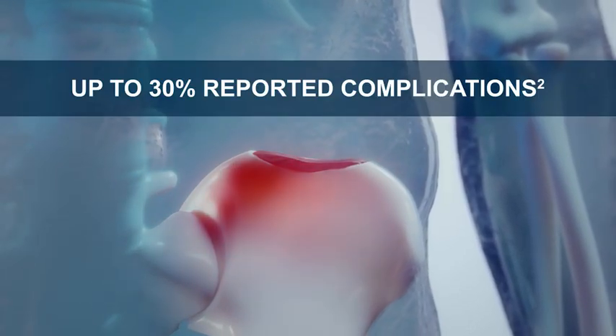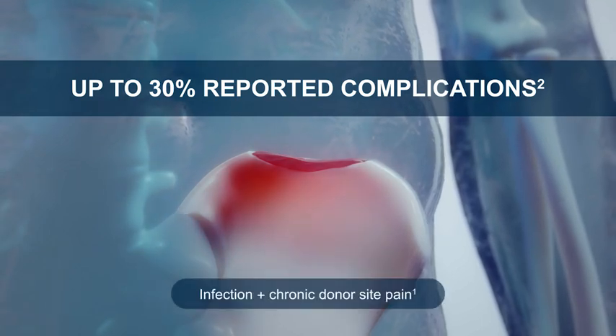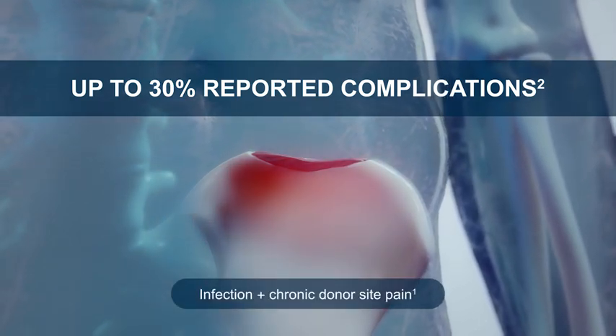However, iliac crest grafting is associated with a number of potential complications, including infections and chronic pain at the donor site.